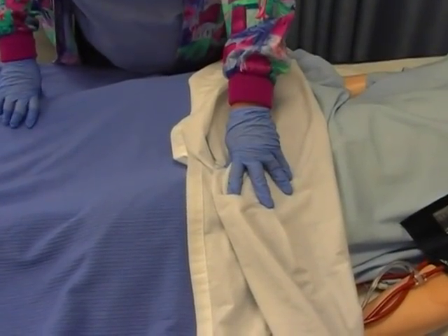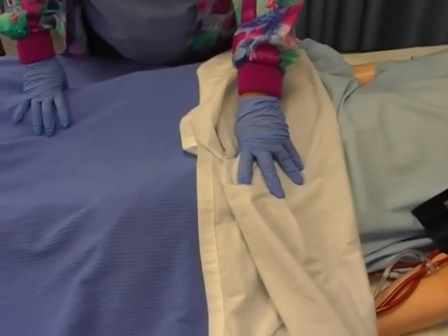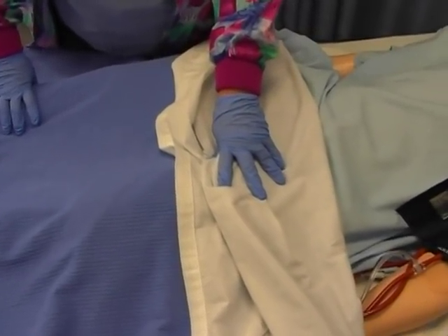Hello, it's Mrs. Sager again. This time we're going to talk about how to obtain a sterile specimen from a Foley catheter.